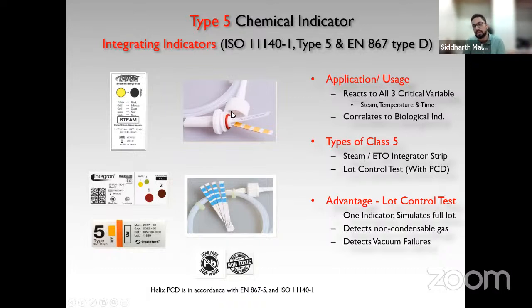Now, this doesn't go inside the drum. This is placed outside the drums at the worst possible location inside your autoclave.